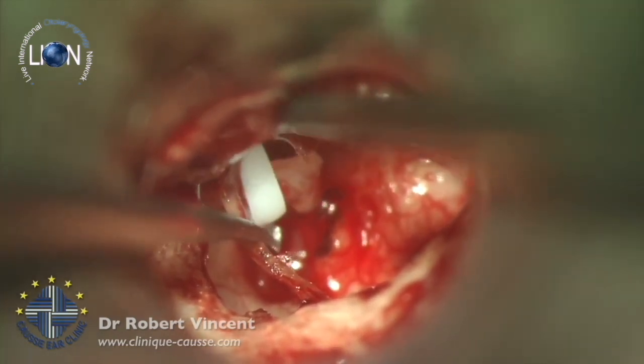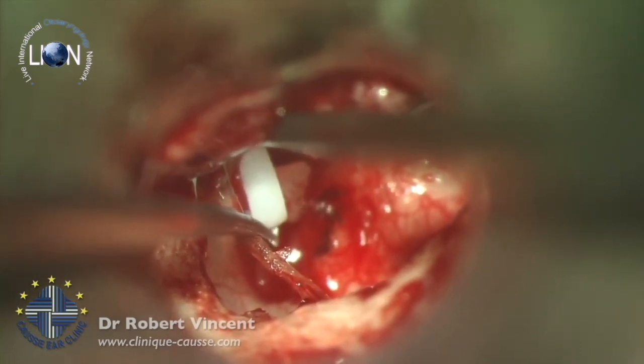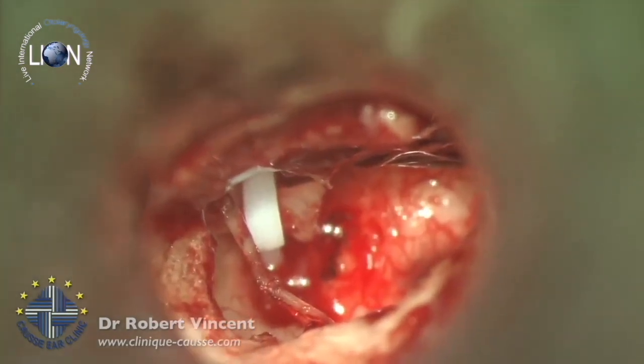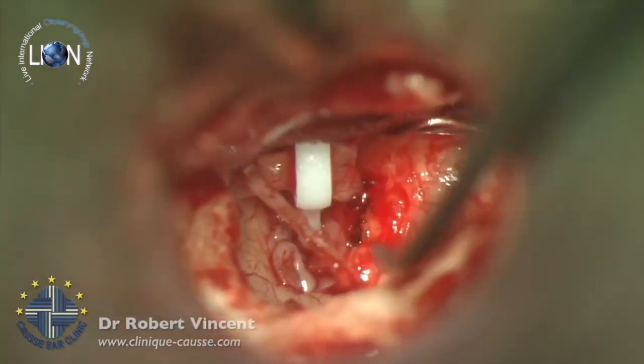So I'm using two hands. You can use a curved forceps, different types of ways of doing that. The point is that there's a memory, but it's important not to believe too much in the memory, to crimp the loop like this, and looking for the bending sign.